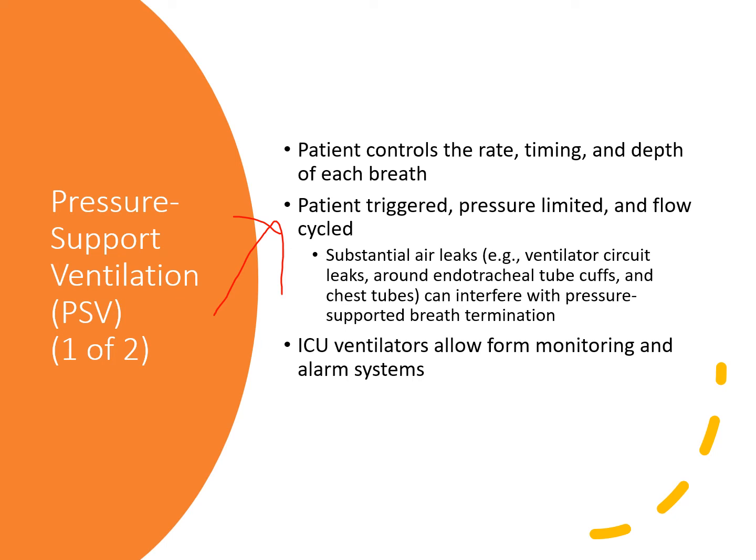So pressure support ventilation, as long as your alarms and your apnea modes and all that stuff are set up safely and correctly, can be a very safe and effective way to wean someone. This is a non-volume supported approach, and it's been shown to be very safe and effective. What we're doing here is that you, as the provider, can adjust the workload for each spontaneous breath to look at conditioning or endurance of the respiratory muscles without causing fatigue.